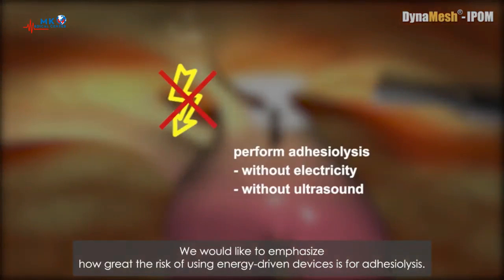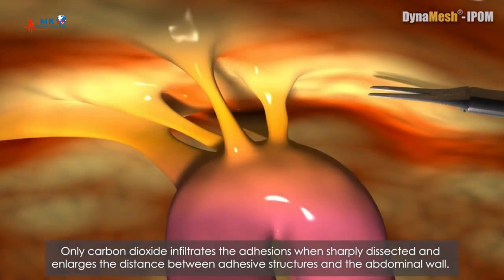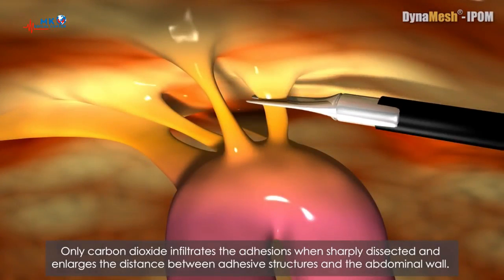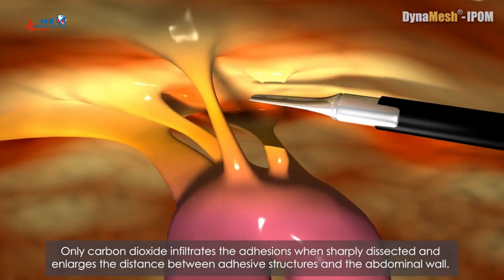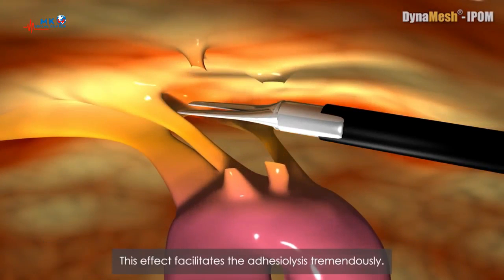We would like to emphasize how great the risk of using energy-driven devices is for adhesiolysis. Only carbon dioxide infiltrates the adhesions when sharply dissected and enlarges the distance between adhesive structures and the abdominal wall. This effect facilitates the adhesiolysis tremendously.